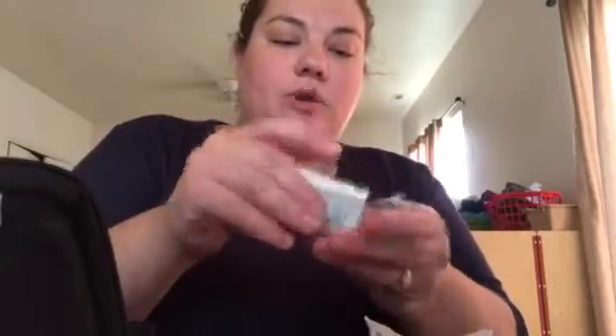So I get an alcohol swab out. Avia, come here, hurry! It's your turn! Okay, come here. Say hi, friends. It's time to get your blood checked — what finger? That one? Okay.